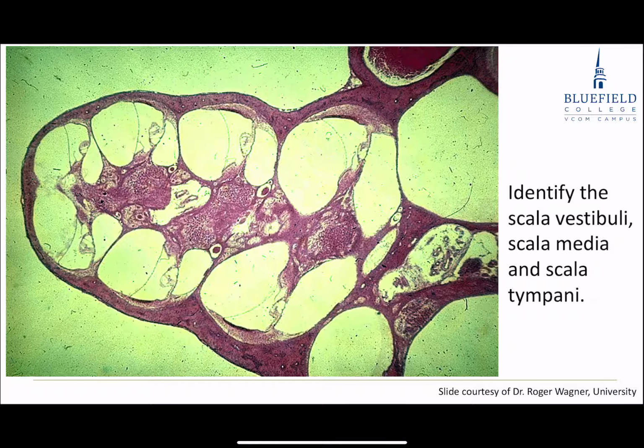All right, here with lower power magnification. Here is my bony peak sticking up, with the organ of Corti wrapped around it. If I just look at one region of the cochlea wrapped around it, here is one region. I can see my organ of Corti, so I know right there that's scala media. Scala vestibuli up here, scala tympani down here. Okay, that's about all I can really see on this.